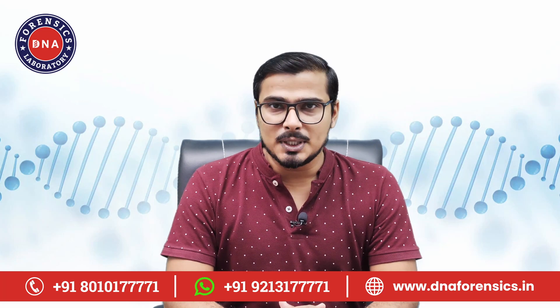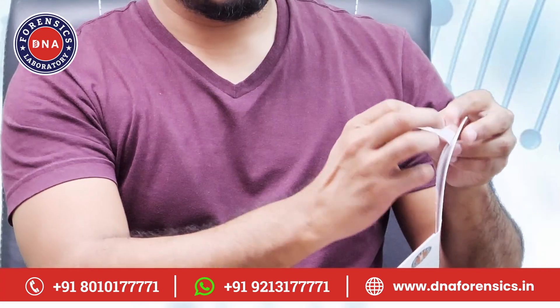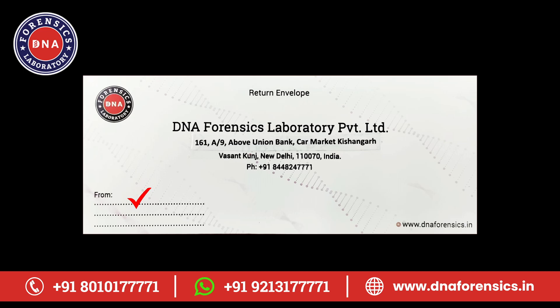Your sample collection is now complete. Now put the consent form and the sample envelopes in this envelope, peel off the strips from the flap, and seal it. Then write your name, address, and mobile number on it and send it to us by courier.